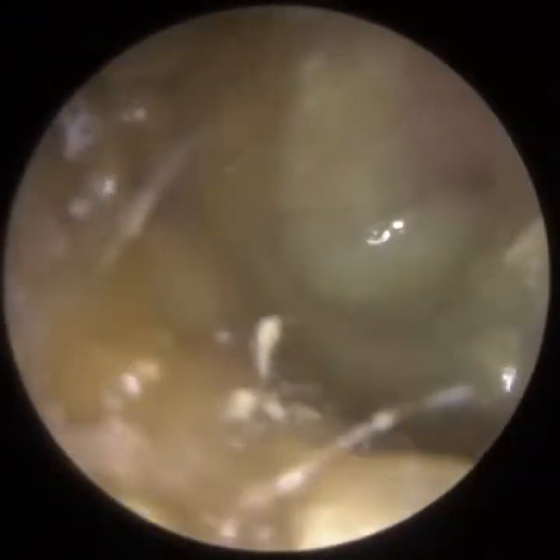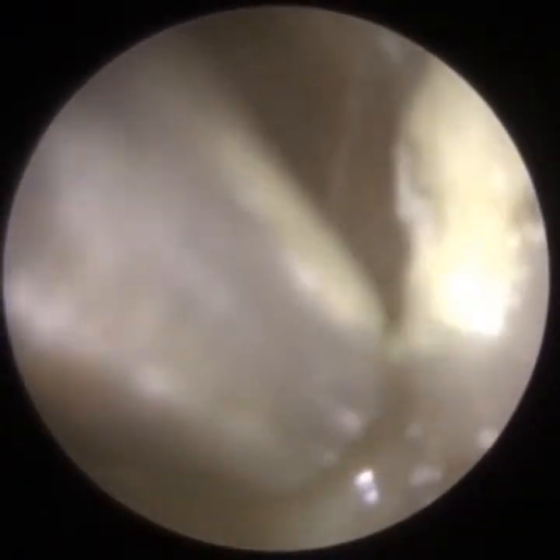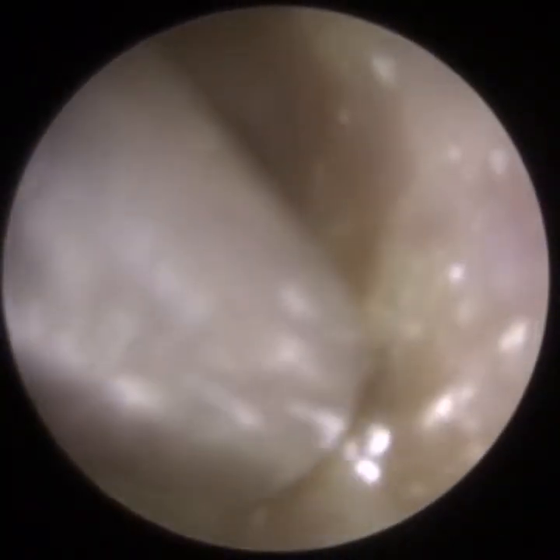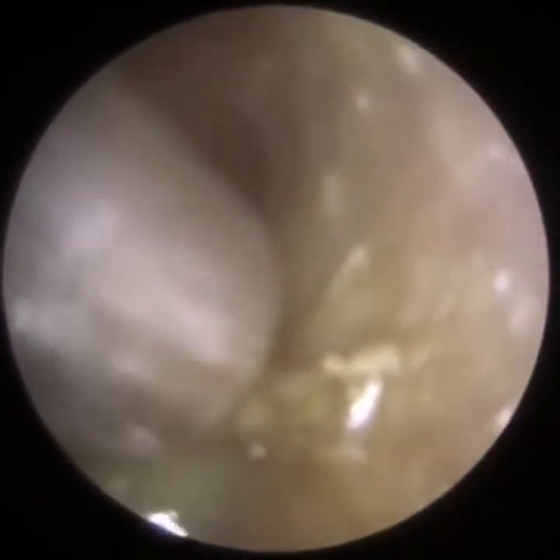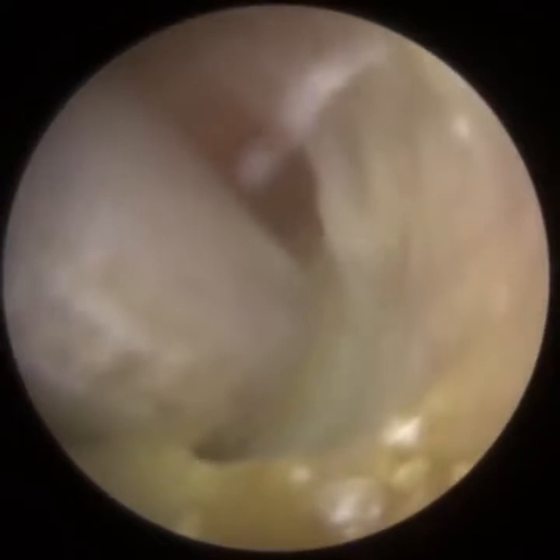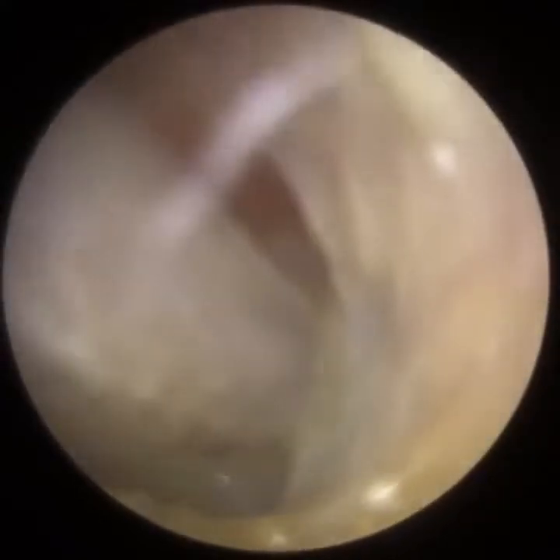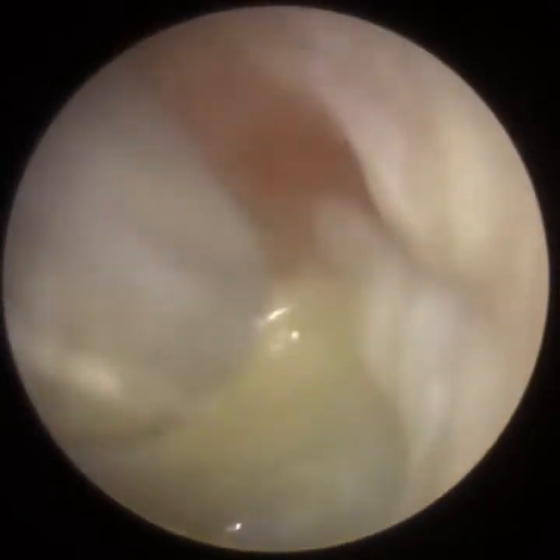Now we come on to the patient's left ear. You can see here the skin has become infected, damp and wet. The undercoat of skin is not crusted like the right, it's a bit more sticky, but it is a lot firmer than the wet debris, this ear pus. I'm just trying to remove as much pus as I can, so it gives me some reference point to where I am in the ear canal.